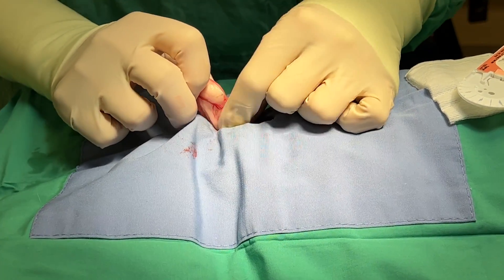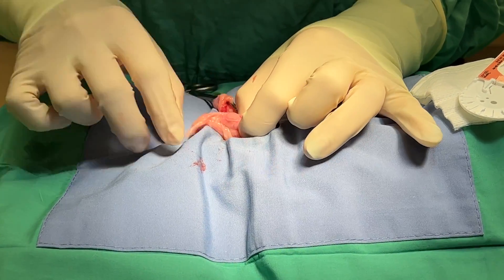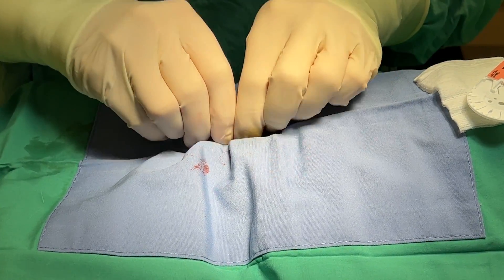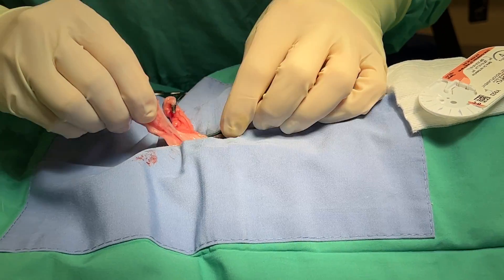Pick up your other side and you can follow it up to your other ovary, which is right here. Once again, pinch your ovary, feel your suspensory, push against the dog, and move your hands caudal. There we go.